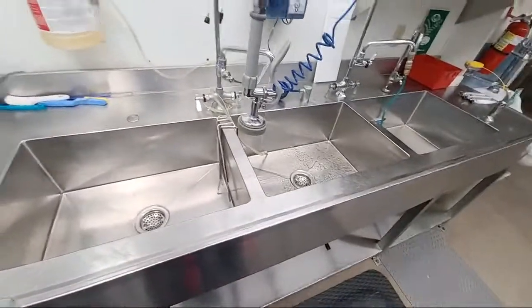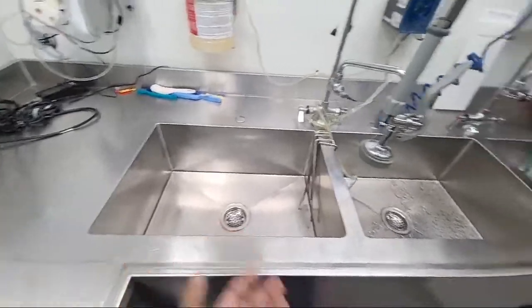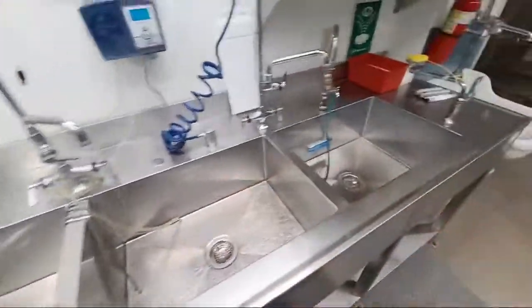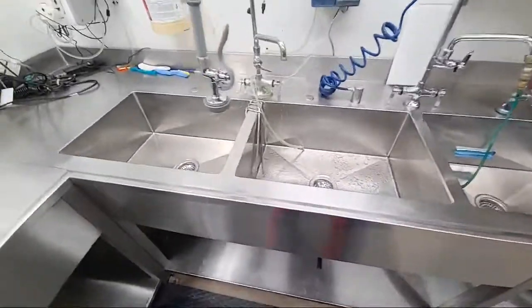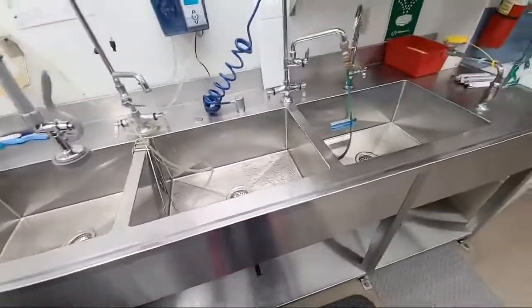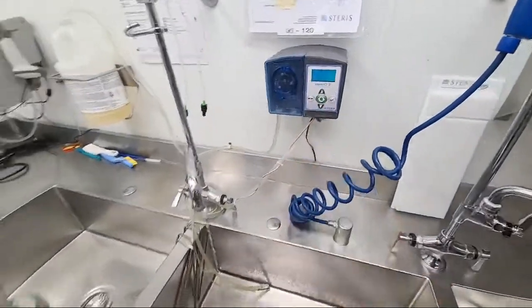Here's the wonderful 3 sinks that we keep hearing about. There's the soak, the wash, the rinse. Usually we only use a couple because we soak and wash and go. So, you don't always need to use all 3, but that is the most proper way and by the book to use every single sink. And those are the buttons we use to release the enzymatics.